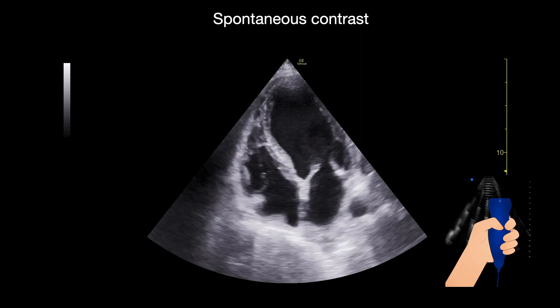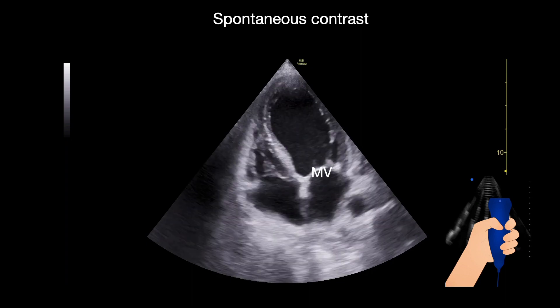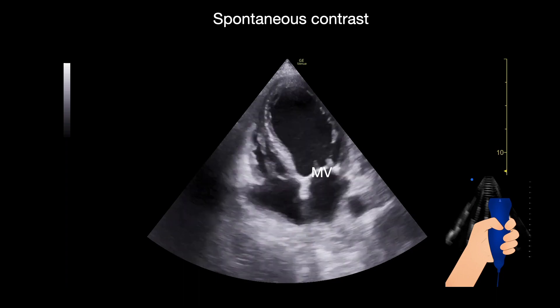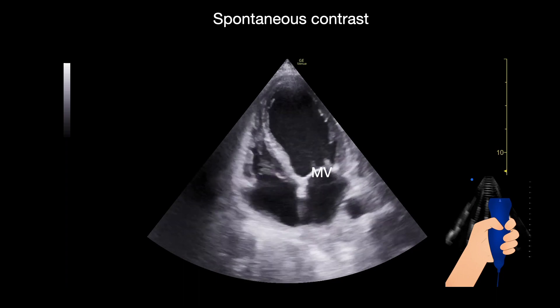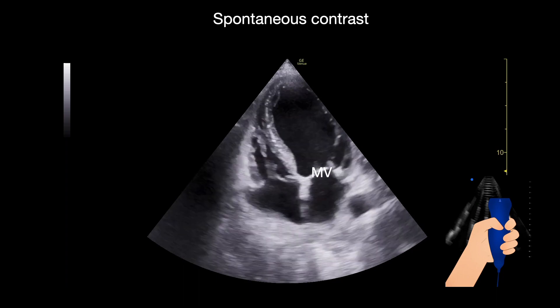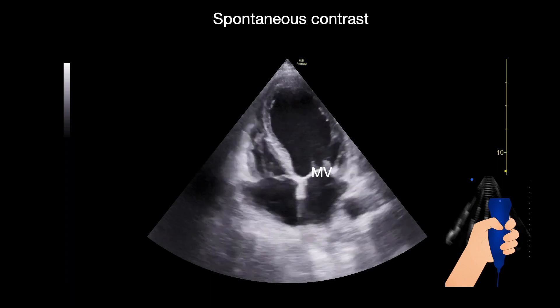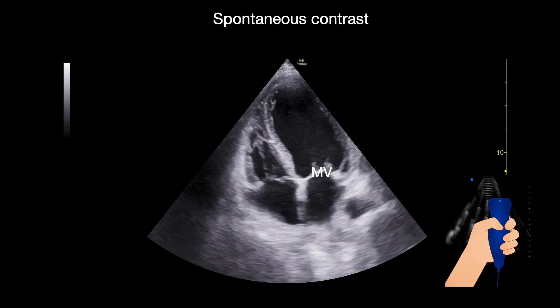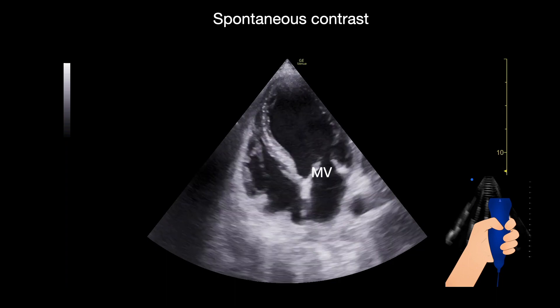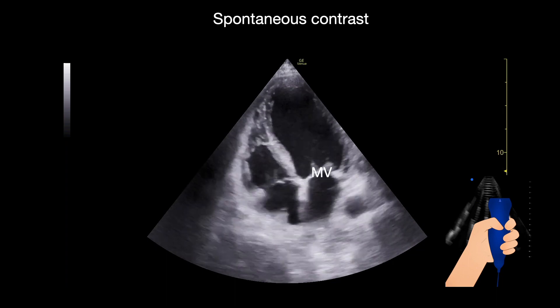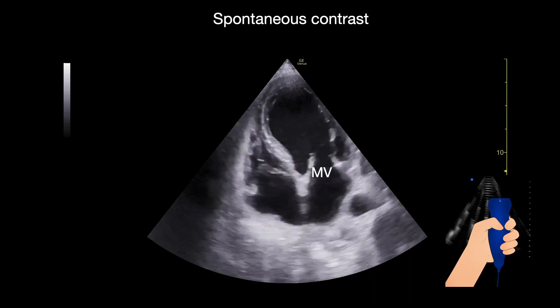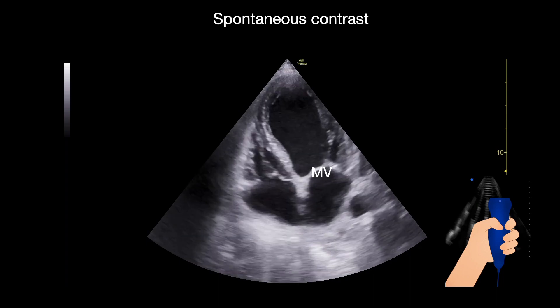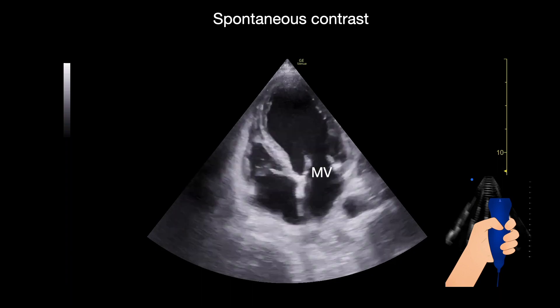You can see how from the mitral valve there is kind of a smoke coming from it, and this is because of erythrocytes and also fibrinogen that are causing this turbulent flow and causing this spontaneous contrast. You can also see that the left ventricle barely moves — this patient has a very low ejection fraction.